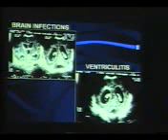The ventriculitis associated with hydrocephalus due to the sequelae of meningitis. If you are using color flow, then we can also see the pyogenic collection and the low-level debris seen in the ventricles. This is the pus collection. You can see ventriculitis plus hydrocephalus: a low-level echo collection seen in the ventricles, floating debris, highly suggestive of a pyogenic collection.